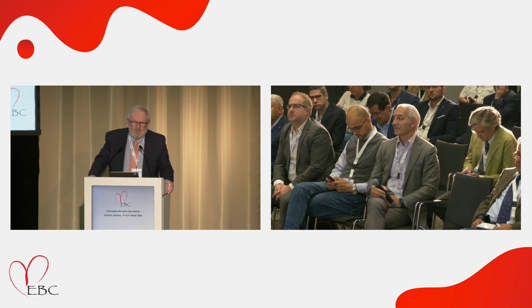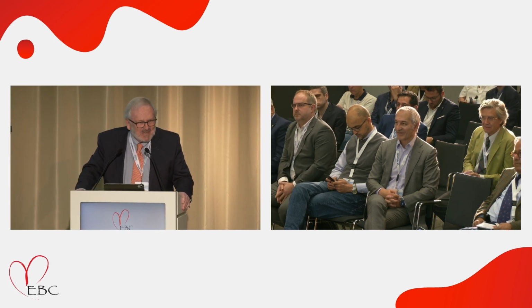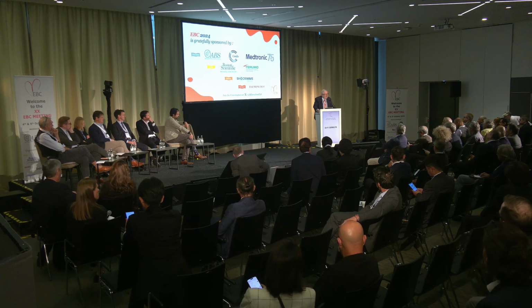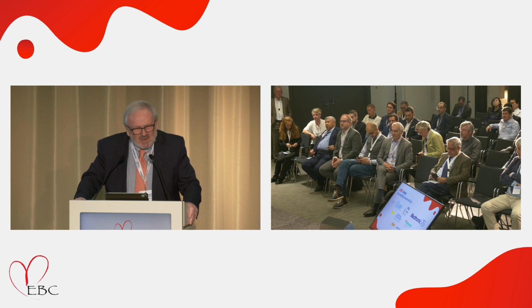Yeah, I think the term which has been coined by Elucid, by Cleerly, by HeartFlow is AI-QCPHA, which is for artificial intelligence, quantitative coronary plaque, and hemodynamic assessment. So it's complete assessment of the coronary artery. The weakness now is, on one hand, you have to recalibrate everything for the photon counting. That's one thing. The second point is that we have to stay away from the categorical. You know, the 80, okay, 80, that's 1994 in the New England. No, it was 75 at that time. And we moved to 80 with the interventional cardiologists because they were not happy about the 75, and there was a plateau there. But I think that has to be recalibrated for the photon counting.